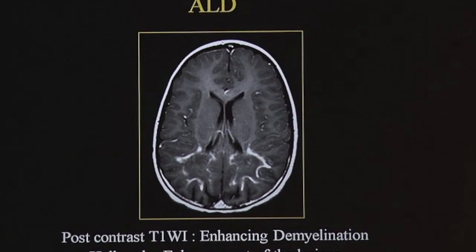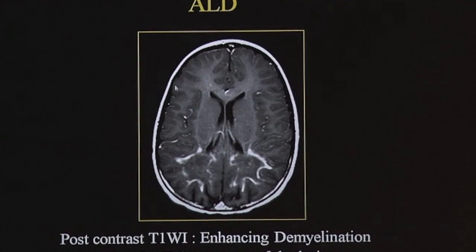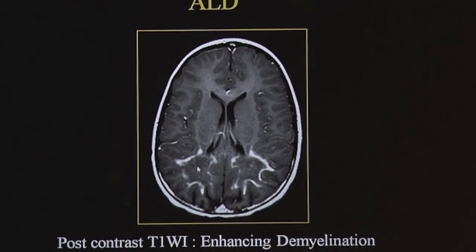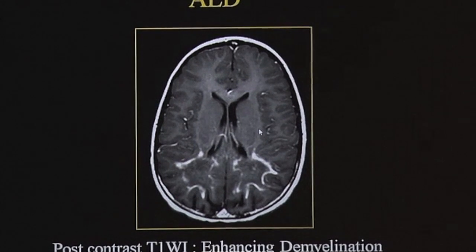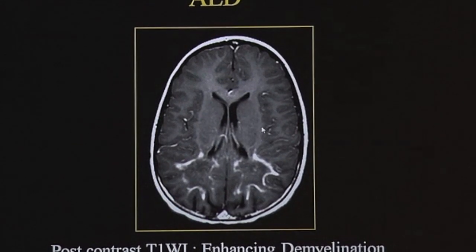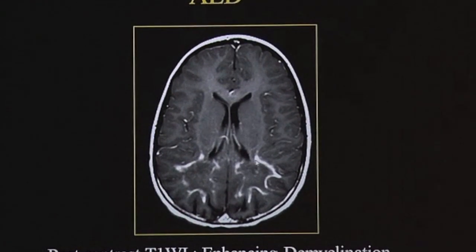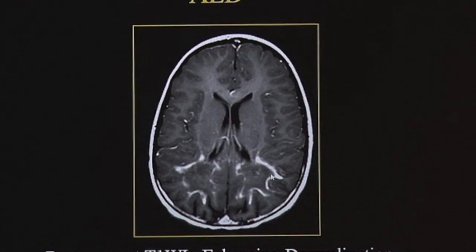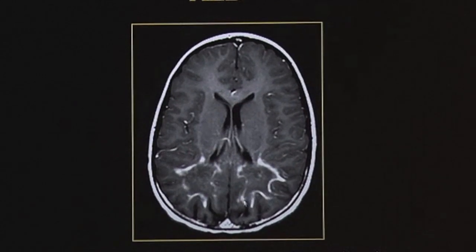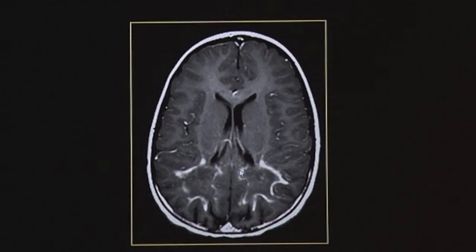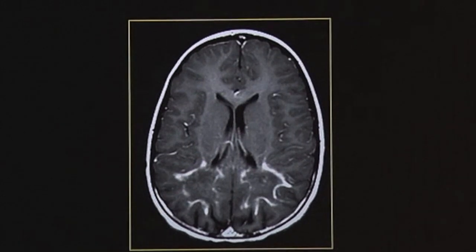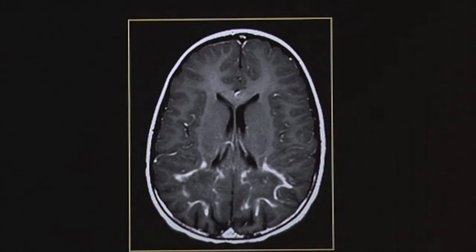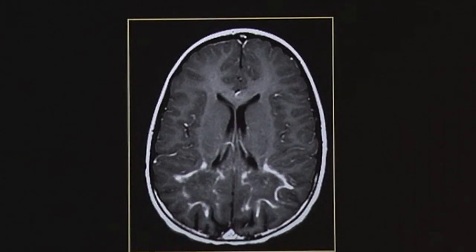This is one condition where you get enhancement at the interface between the affected and unaffected white matter — here is the affected white matter, here is the unaffected white matter, and at the interface of disease progression you see this enhancement. This is classic. There are only two conditions which show enhancement: one is adrenoleukodystrophy and the second is Alexander's disease.